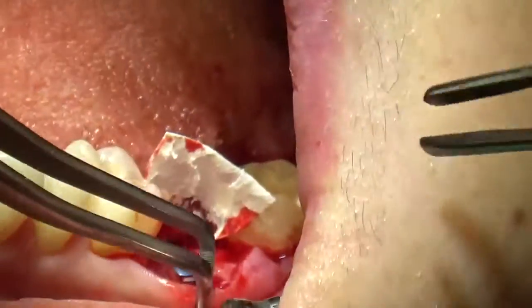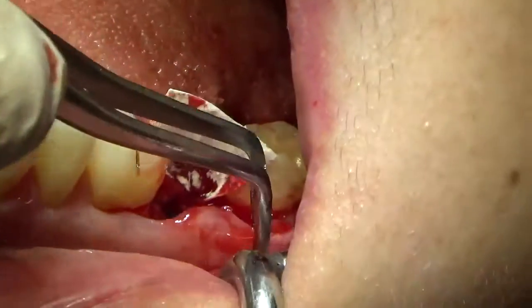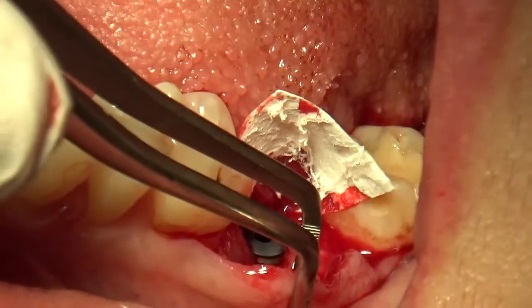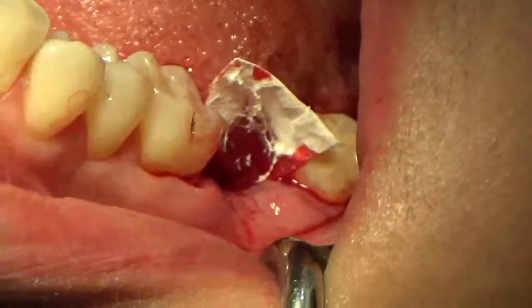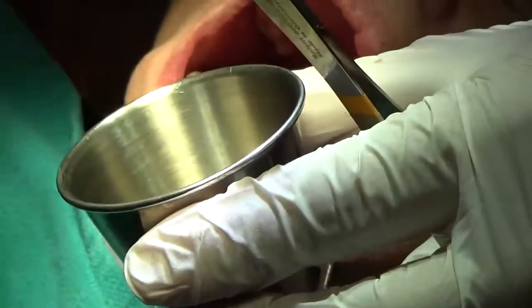So now we've got our buccal area that's bleeding now, by the way, which it wasn't bleeding before. That makes me feel a little bit better. Now we can actually take some graft. So I'm taking just particulate BioOs here. Nice BioOs. We'll check out the consistency.